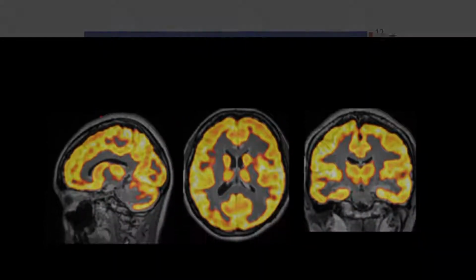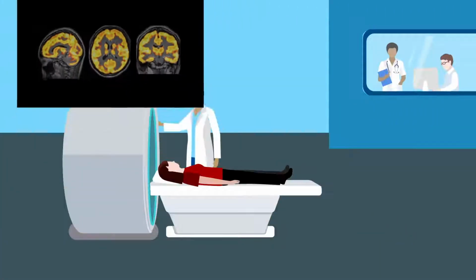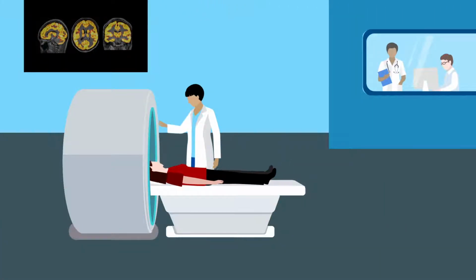One limitation of the method is the absence of motion information if MRI and PET are not active in acquiring images, such as when switching image contrasts in MRI. But overall, the procedure is highly capable of removing PET image artifacts and errors that could mislead doctors.